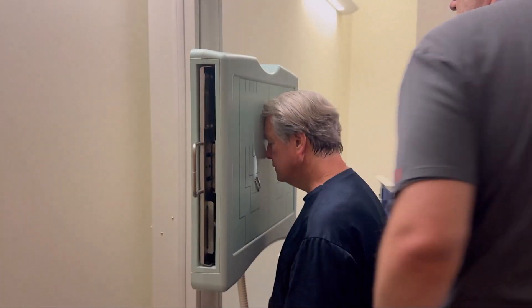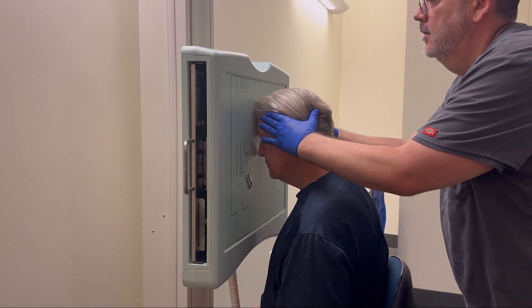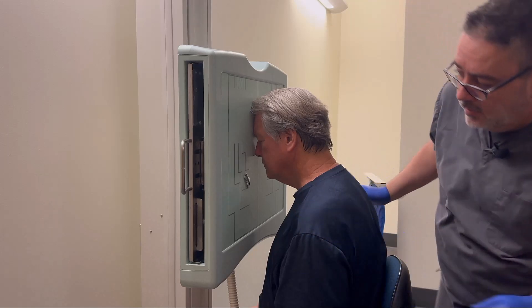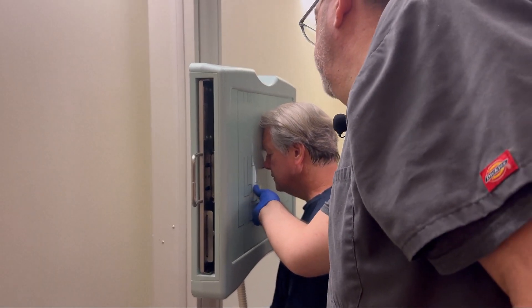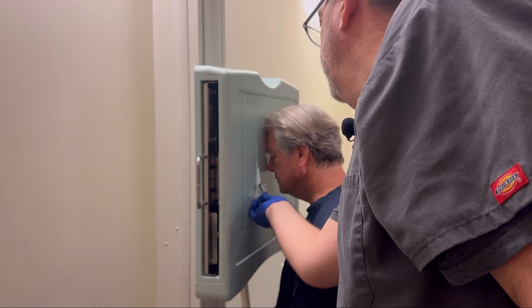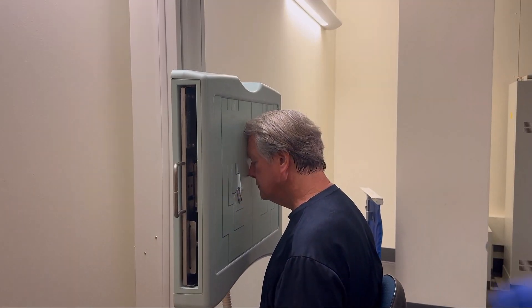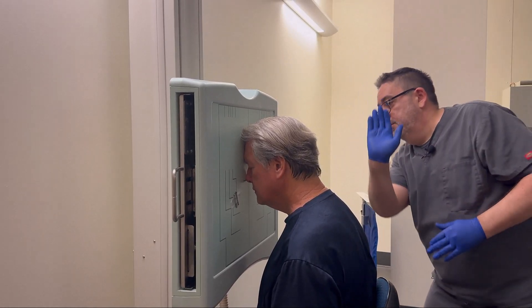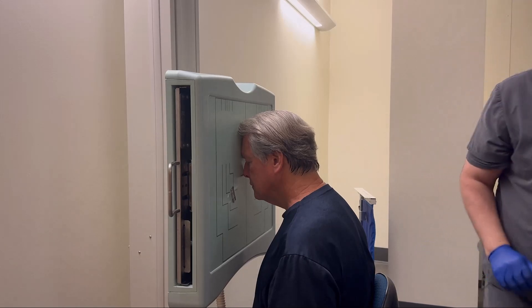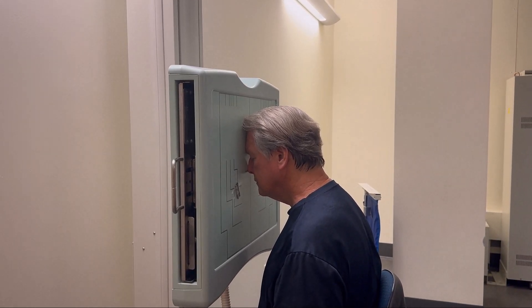Alright, so I'm checking for rotation — we've got a little bit here. You want to make sure your marker's in the light field, but not superimposing the mandible. That looks good from here. Make sure you're looking at the top for rotation, side to side for tilt. And take on suspended respiration. Okay. Thank you.